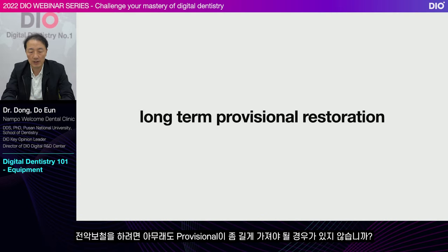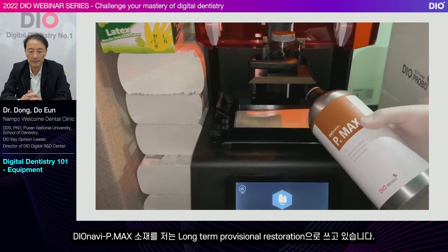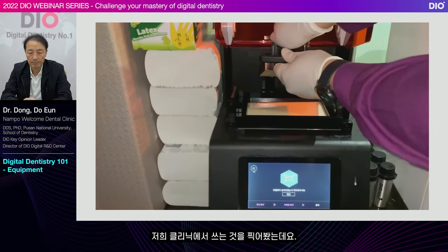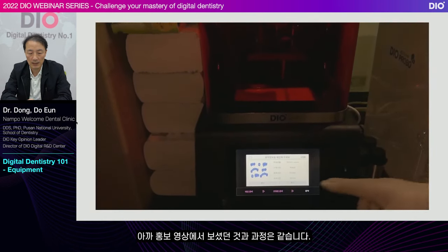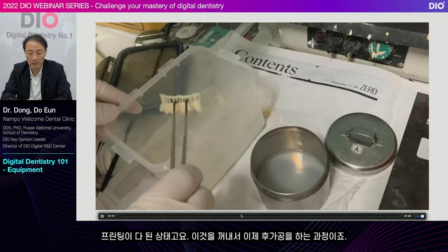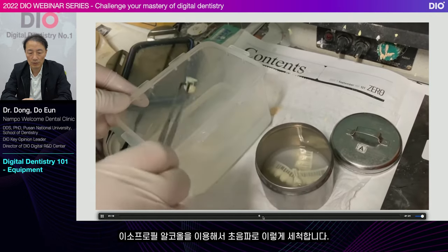For a full arch prosthesis, you would expect the provisional restoration to be used for an extended time, right? So I use the Do-navi PMAX material for long-term provisional restoration. I made a video of it being used in my clinic. The process is the same as the one you saw in the promotional video. The printing has finished. Now it needs to be taken out for post-treatment. This cleaning is done with ultrasonic and isopropyl alcohol.